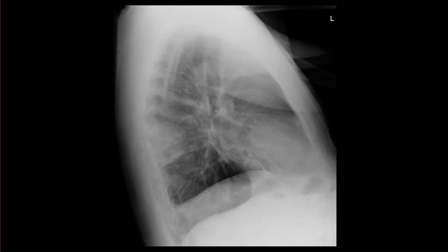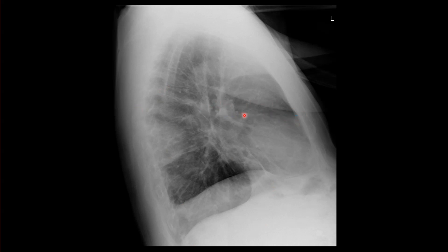Let's look at the lateral view. Here you can faintly see the oblique fissures — the major fissures — extending across the chest, indicating that this is all lower lobe here. The minor fissure faintly extends across in this direction, so this would all be right middle lobe and lingula superimposed over each other, and then upper lobe up here. So that tells you that this consolidation is in the superior segment of the right lower lobe.